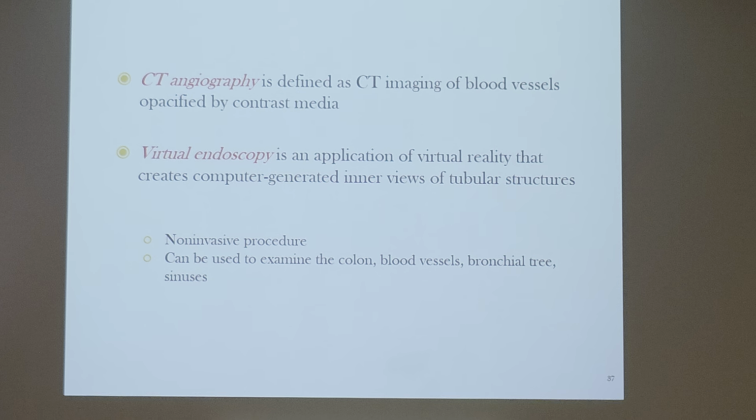All right, good. So CT angiography is basically another area where we are looking at flow, speed, things like that. Have you seen a lot of angiography in your space? Do the gated heart studies, I don't know if that would be considered. It is. We do a lot of them. You're basically saying the gated, you're using a machine.